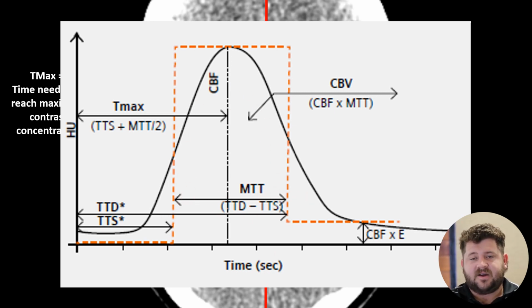So again, as radiographers, this is pretty in-depth. You don't need to know this. We just need to know how these particular results affect what it determines is our core and what it determines is our penumbra, and how this gives us the chance of a better or worse outcome for our patient.